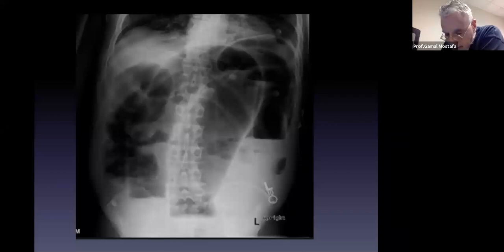The other patient in a psychiatric ward or floor, or bedridden or paraplegic for the last 5, 6, 7, 8 years, taking narcotics, taking psychiatric medications, coming to the ER, abdominal distension, with history of repeated similar presentation for the last 3 or 4 years and hospitalization. Getting an X-ray like this, you log into the system, you see that he's been having that for years. Colonic inertia. Totally different disease.